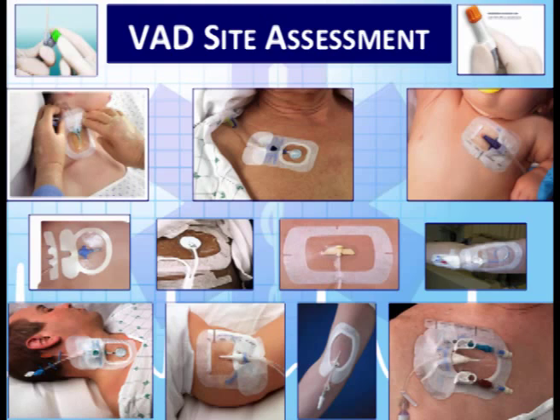We have an arm, a couple of chests, a neck device, and I'll tell you the neck devices and the groin ones are the hardest to keep occlusive. When you turn your neck, that dressing sometimes isn't always intact. Same thing in the groin, that dressing tends to peel up. So if it's not looking like a good dressing, ask them, hey, do you think you could please help us out and change the dressing before we take this patient?